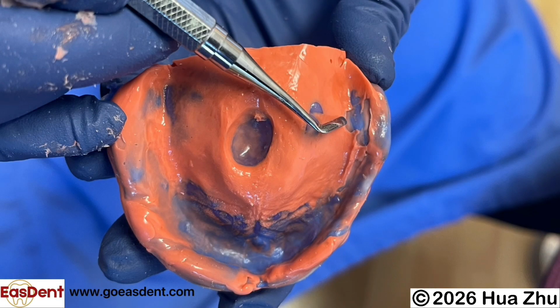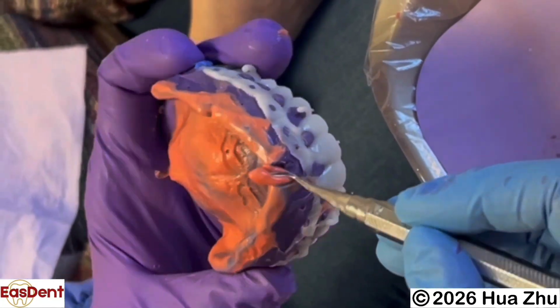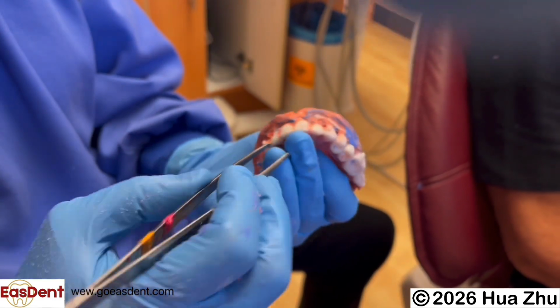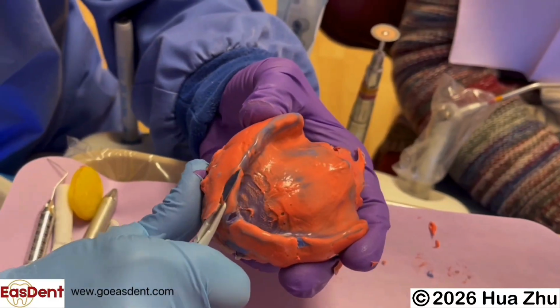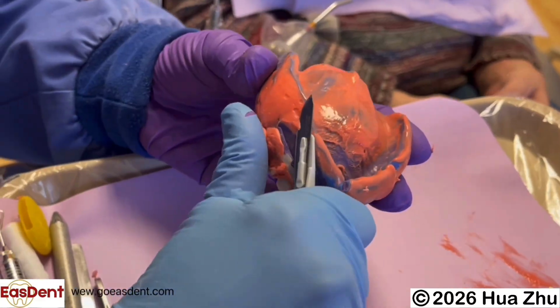After the material is set, evaluate the final impression. If necessary, you can repair the impression with light body PVS impression material or sticky wax. Make sure no impression material is left on the occlusal surface to interfere with the occlusal contact with the opposing arch. Cut away extra impression material on the buccal, lingual flanges, and palatal area.